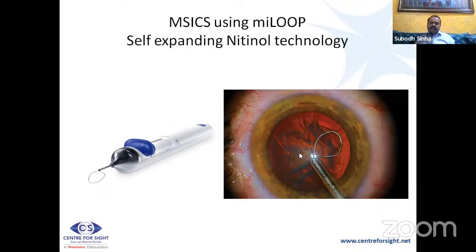nitinol wire so that it divides the nucleus and at the same time prolapses into the anterior chamber. So this looks like a safe technique compared to the earlier phaco-fracture techniques, since this technique is dividing the nucleus in the bag itself.